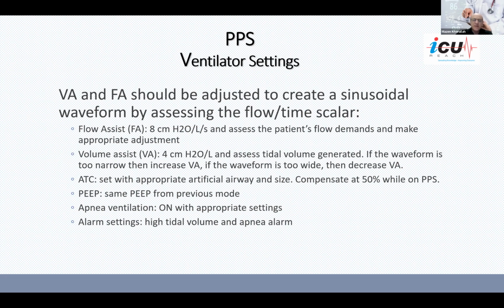And usually, as I said, the automatic tube compensation is set at 50%. PEEP is taken from the same level that you used on the previous mode. And of course, you need to have apnea ventilation on, just in case your patient goes apneic, and you have a backup plan for that, or backup mode. Also, you need to have alarm settings for high tidal volume and apnea.